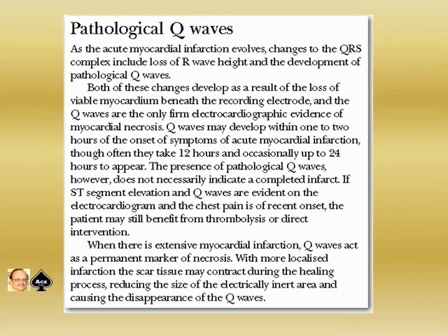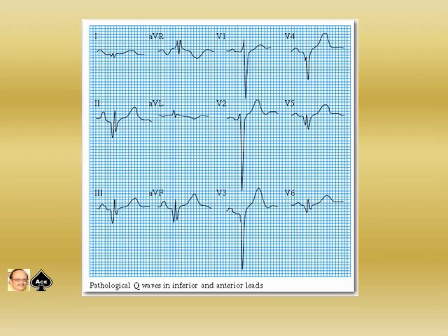With more localized infarction, the scar tissue may contract during the healing process, reducing the size of the electrically inert area and causing the disappearance of the Q waves. The pathological Q wave is shown in the picture in the inferior and anterior leads.